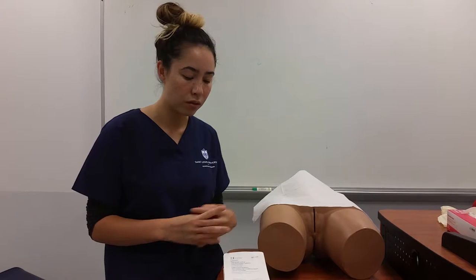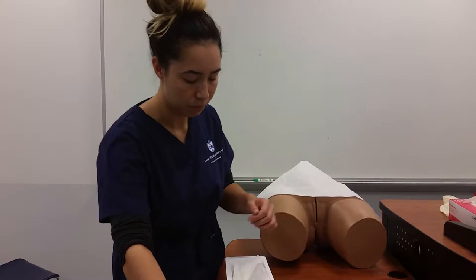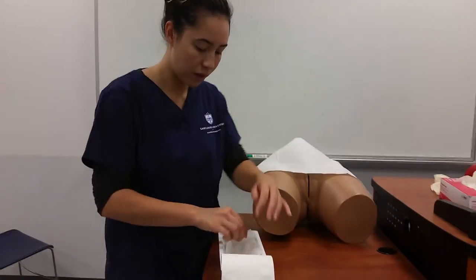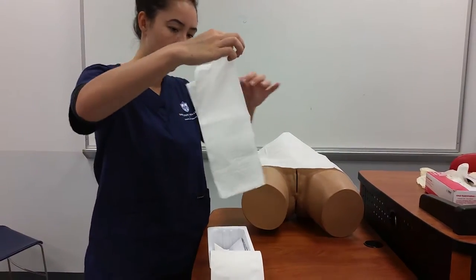I would then ask her to be in a dorsal recumbent position so that I can set up my sterile field and perform the catheter. First thing I would do is open my sterile kit. I would then grab the sterile field.